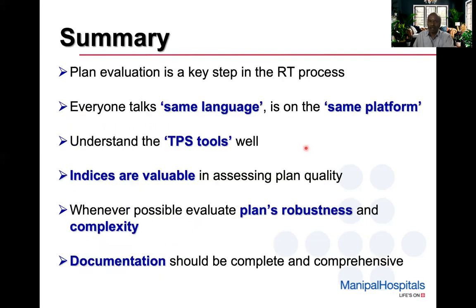So to summarize, plan evaluation is a very important step in the whole RT treatment delivery chain, for the reasons I already described. Ensure that everyone talks the same language and is on the same platform so that nothing is mistaken.